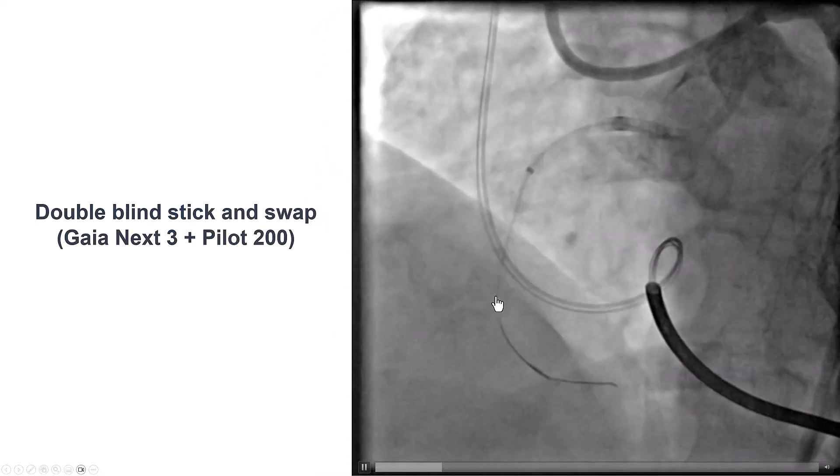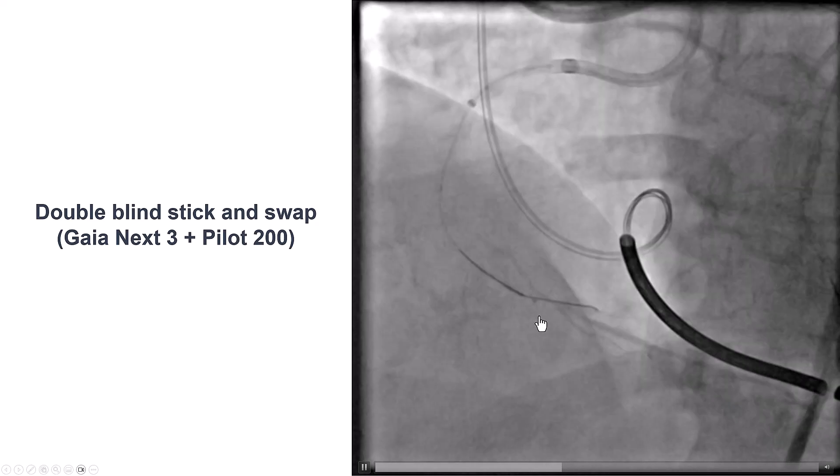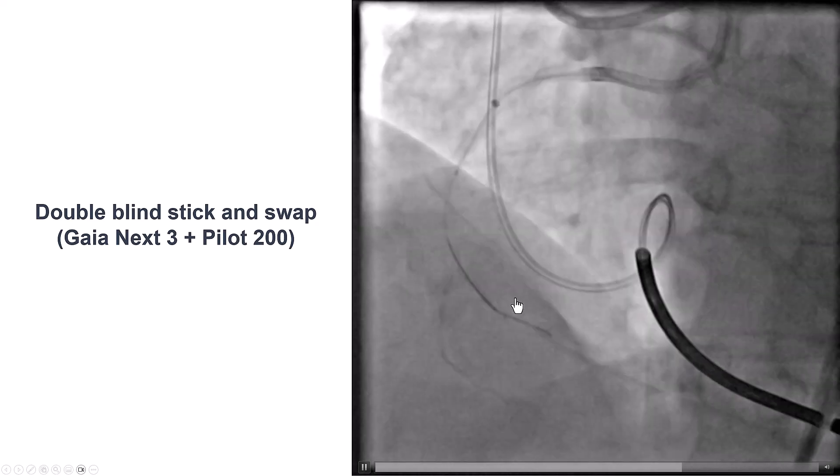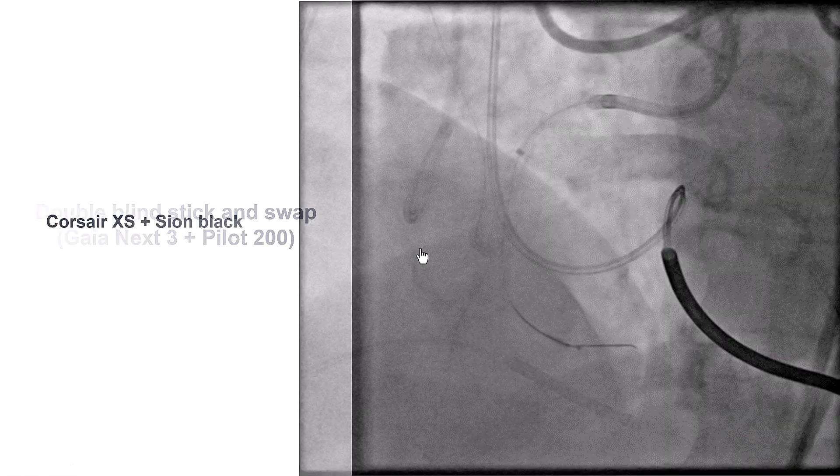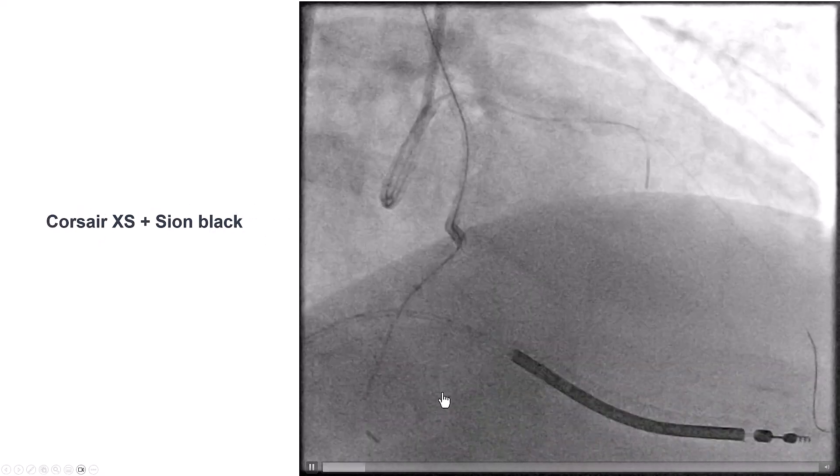At this point we decided to try to re-enter. We delivered a Stingray balloon and did a double blind stick and swap with a Gaia NX3 and a Pilot 200, but unfortunately we were unable to get in.